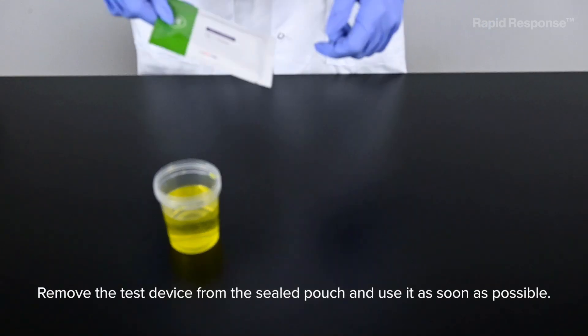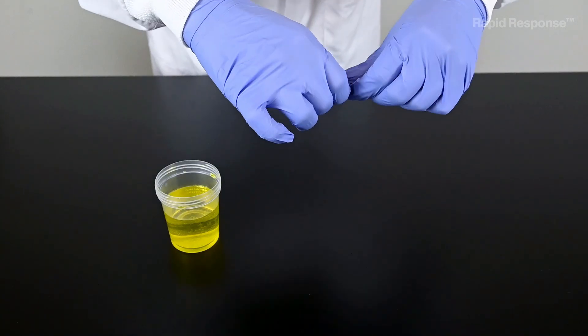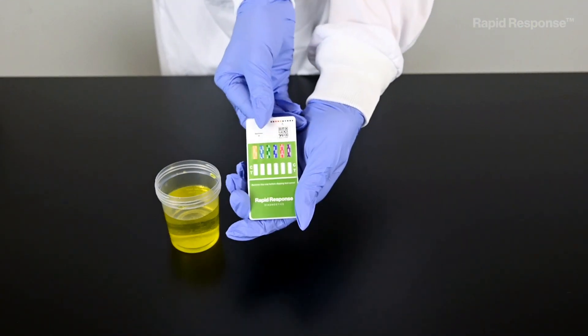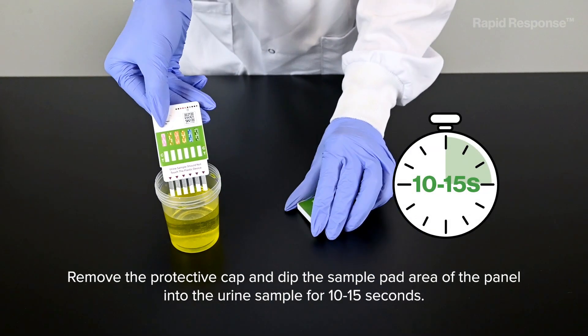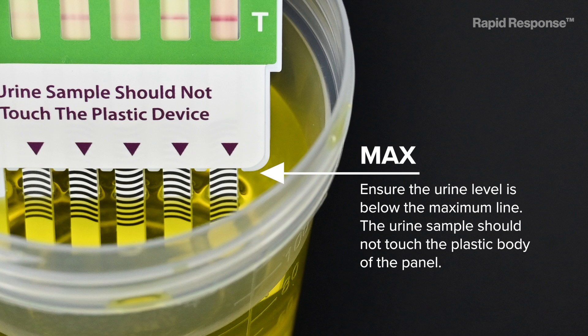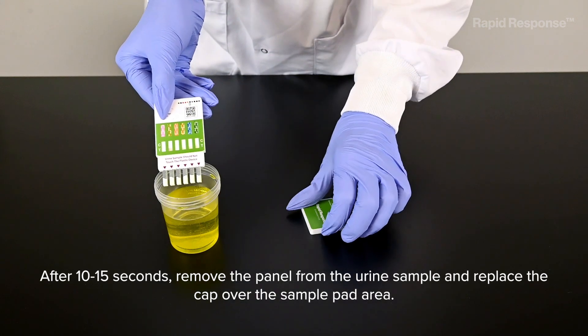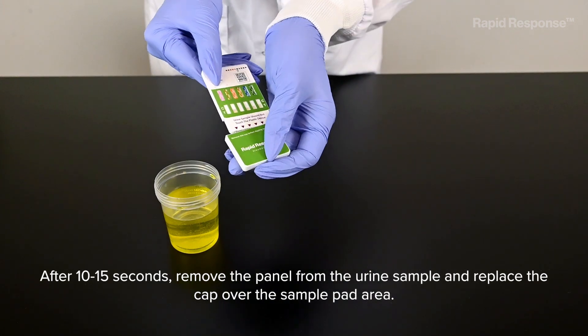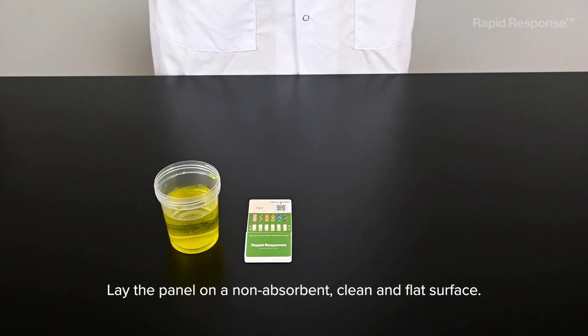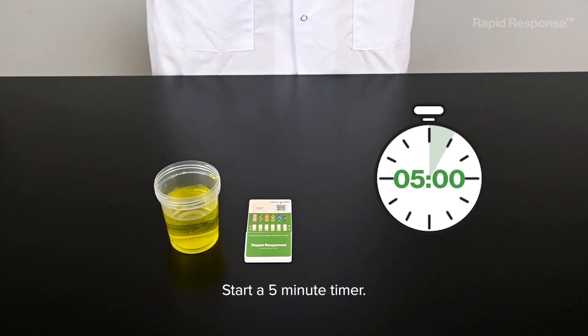Remove the test device from the sealed pouch and use it as soon as possible. Remove the protective cap and dip the sample pad area of the panel into the urine sample for 10 to 15 seconds. Ensure the urine level is below the maximum line. The urine sample should not touch the plastic body of the panel. After 10 to 15 seconds, remove the panel from the urine sample and replace the cap over the sample pad area. Lay the panel on a non-absorbent, clean and flat surface. Start a 5-minute timer.